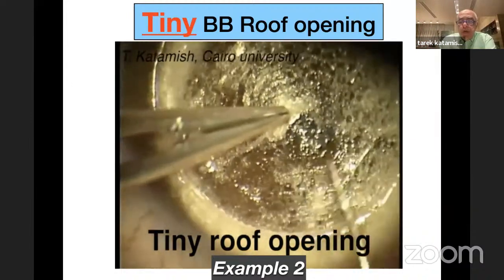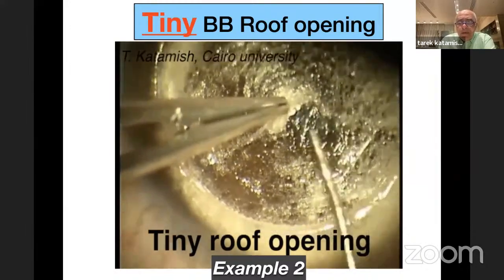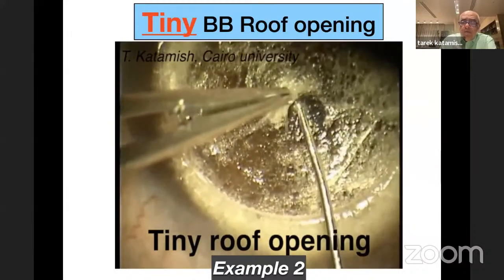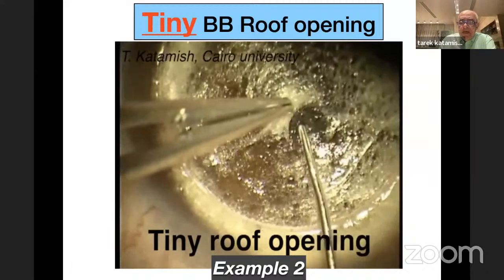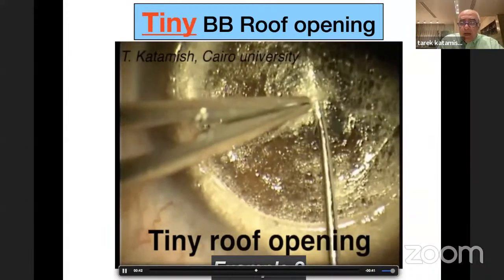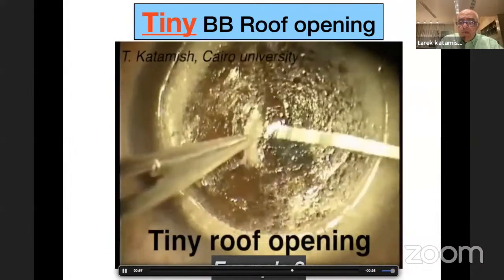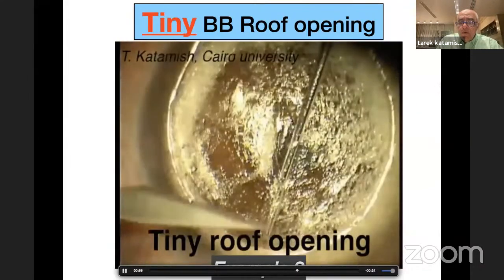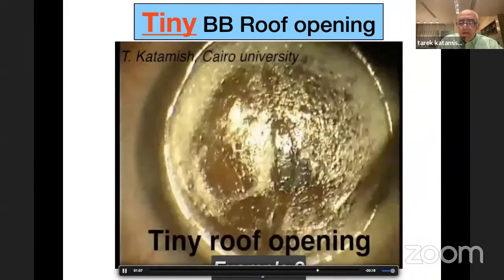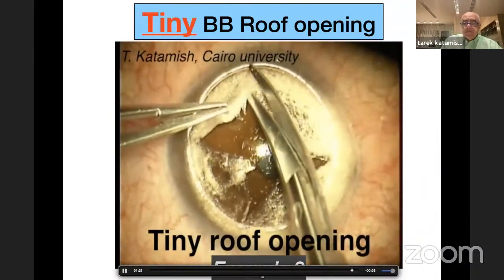So you have to increase magnification. Look carefully for this tiny opening, because you want to introduce your scissors and cut the remaining stroma. So you have to look carefully. You see, I am spending a lot of time looking for this tiny perforation until, with some patients, I find this perforation, and using a super blade, I can cut over it, you see, until I have the large opening, and then I continue my operation safely, as you see.